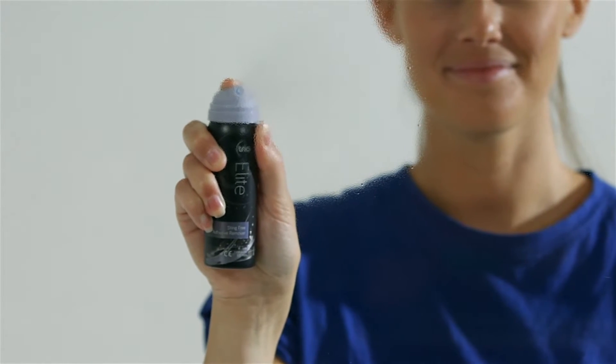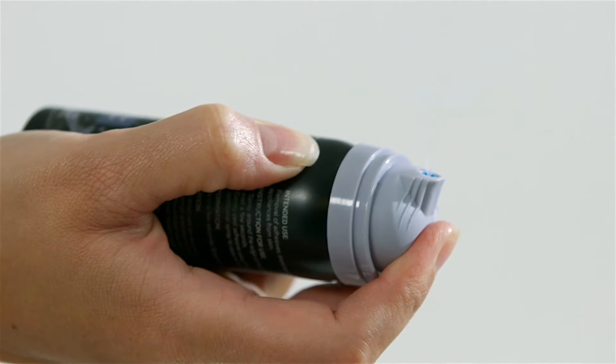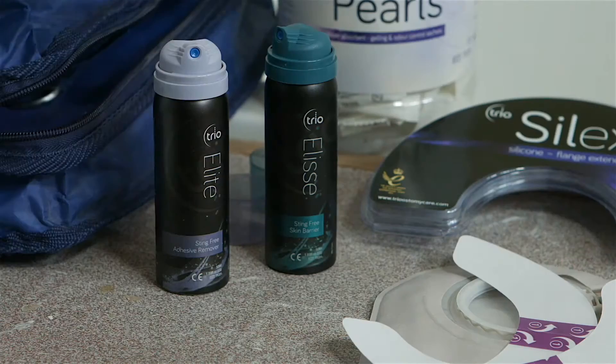I use the Elite Spray. It's dead easy to use. Sprays in any direction, it's fantastic. Some of the other sprays, if you spray it upside down or anything, you seem to get a bit more of the remover or a bit less of the remover and it's not quite as effective.